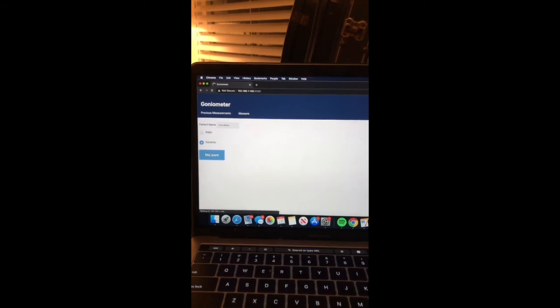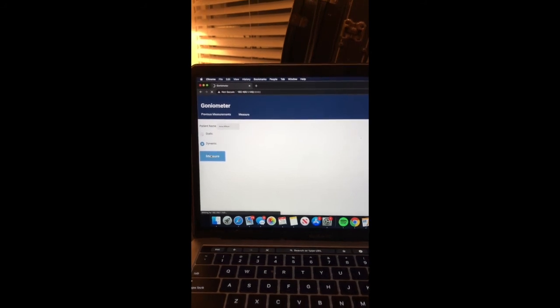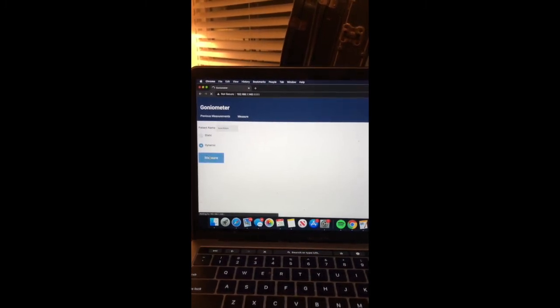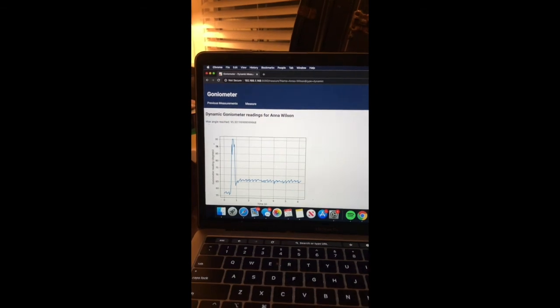These are also calculated to angles using the same calibration from the static, and this shows the dynamic reading page, which shows the maximum angle reached during this time period, as well as a graph of the patient's movement during this time period. The graph shows the angle that the goniometer reached over time.